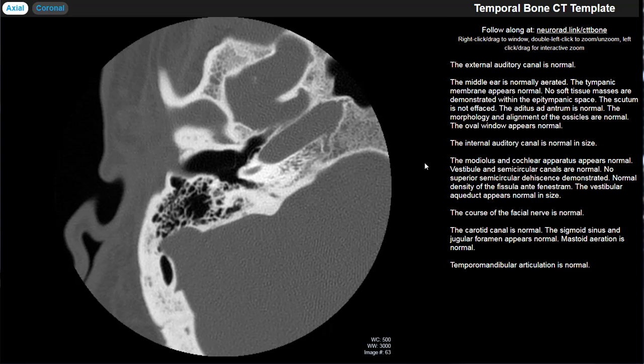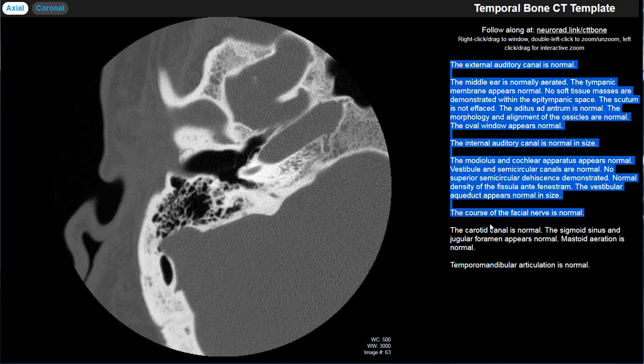This is a quick tour of a temporal bone CT. The intention is that if you're a new resident or wanting to brush up, this can quickly get you familiar with all the different structures you look at on a temporal bone CT. I'm going to do that by going through the template that I use for dictation that outlines all the different structures that I look at.